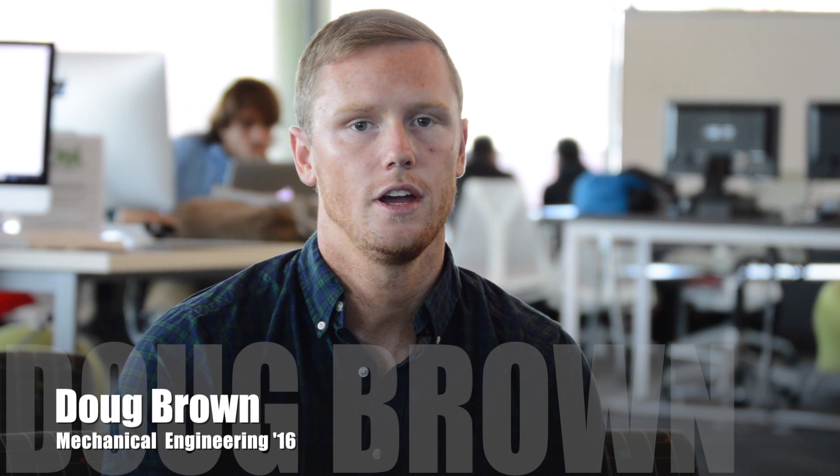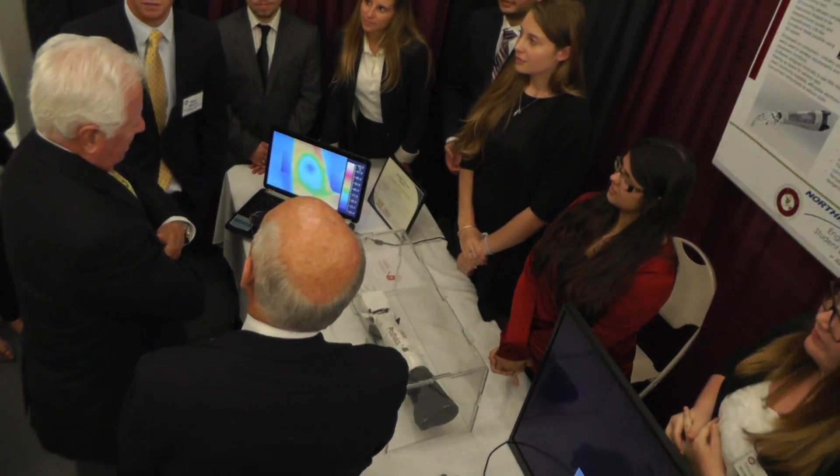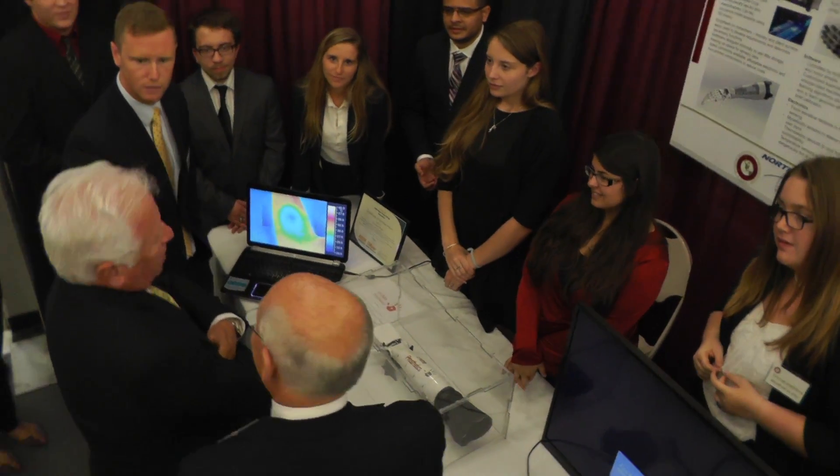Our prosthetic arm project was based and given down by the biomedical department for a senior design showcase. Our whole arm is manufactured by 3D printing — the only things that are not 3D printed are the electronics and the sleeve in the arm.